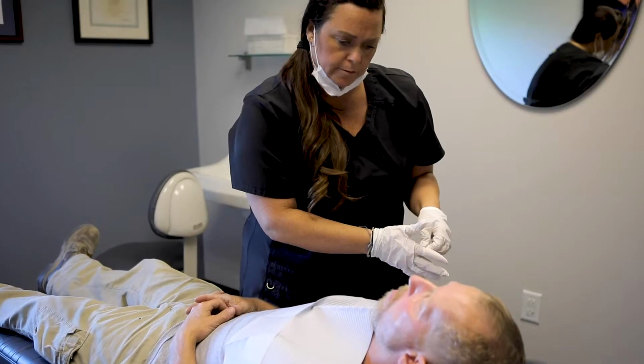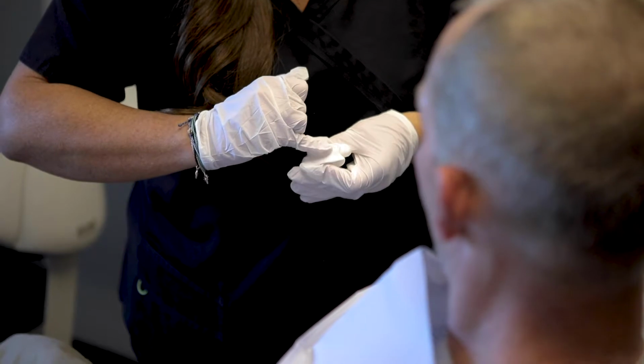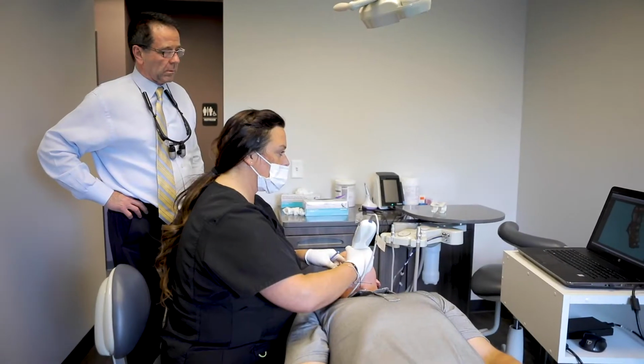You know, a lot of people ask, what is a sleep device? If you're not talking about CPAP, and again, being the gold standard, if everybody can wear a CPAP, that's great. What do you do with the 45% that cannot wear a CPAP? Or maybe they're very mild sleep apneic. There are FDA approved devices in which what we do, they're custom fit.